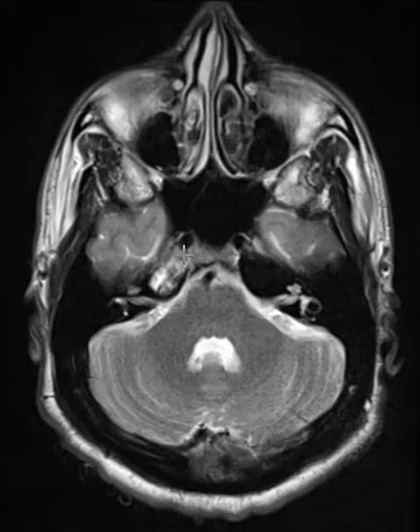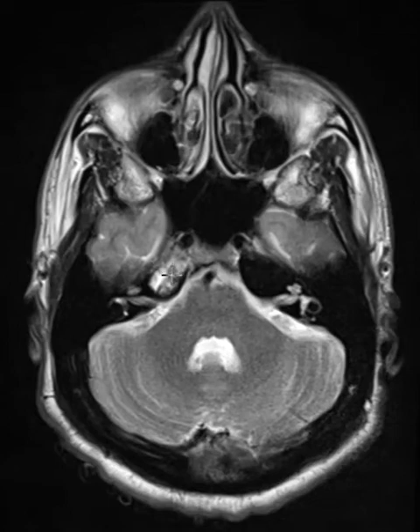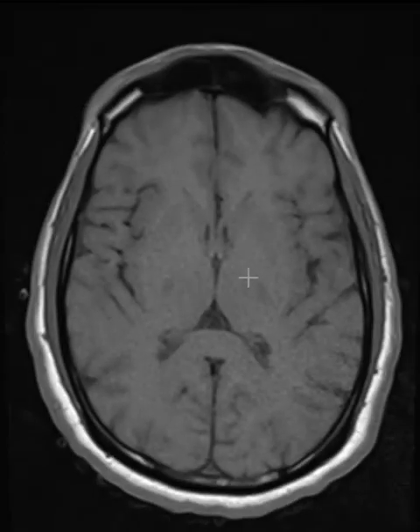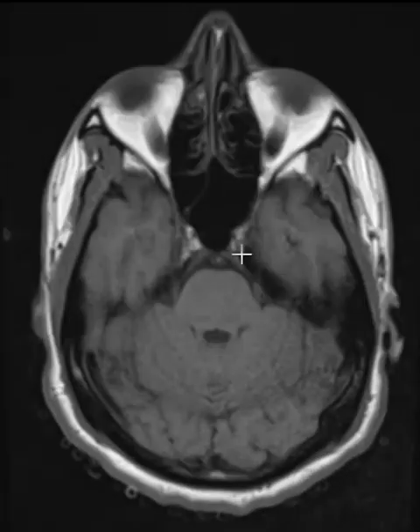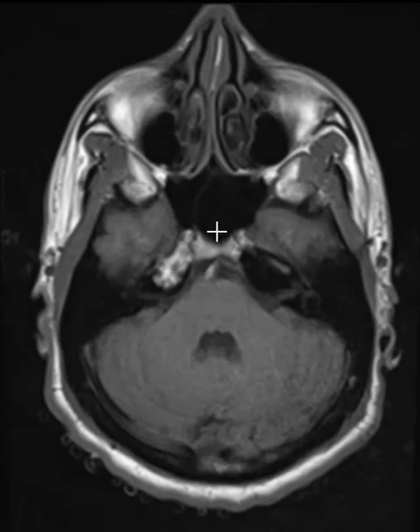We need to look at a sequence where we can see fat. On this sequence, fluid here in the fourth ventricle is bright, and fat underneath the skin here is also bright — so both are bright and we really don't know if this is fat, fluid, or some combination. We need to turn to another sequence called a T1-weighted sequence. On this T1-weighted sequence we're going to go down there and see.